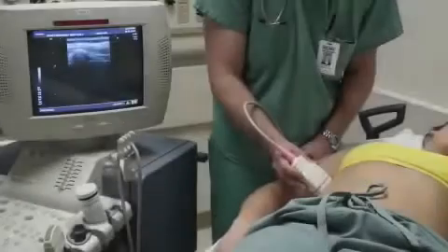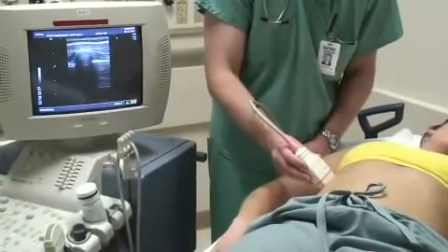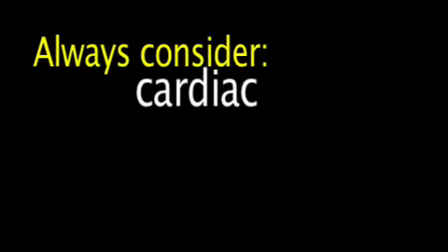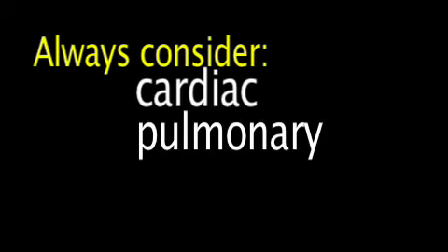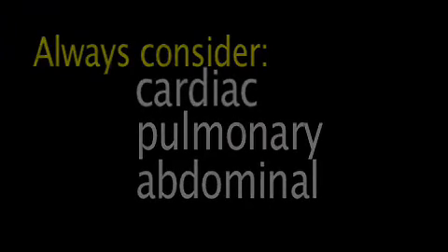You may have to scan through several different ribs to find the exact rib with the fracture. Of course, even a diagnosed rib fracture does not completely exclude cardiac, pulmonary, and even abdominal pathology. But visualization of the fracture can make you more confident that you have isolated the source of the patient's pain.